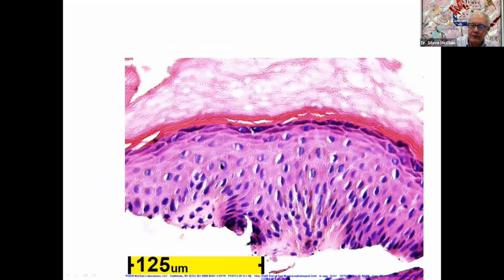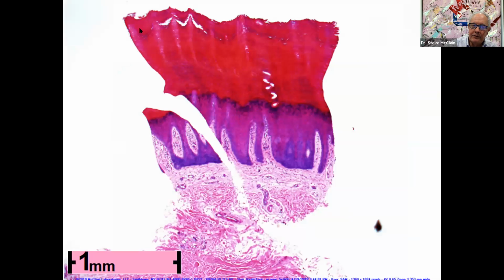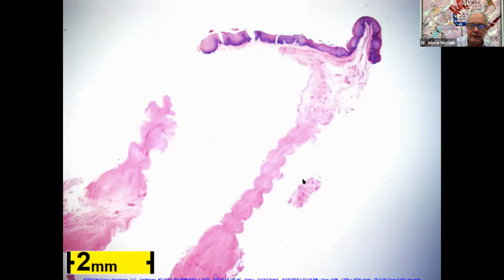There's bad biopsy techniques. The foremost one is to use the wrong technique. Here, the pigmented lesion was sampled by a curette. We can see the pigment, but we can't tell much about what it was because there were only 0.5 millimeter fragments. This is what happens when the punch didn't come out, so they attempted to put the punch back into the skin. Usually bad technique. Okay, don't try and cut it off again. If you fail, you can go to a slightly different site, or you use your anesthetic needle.